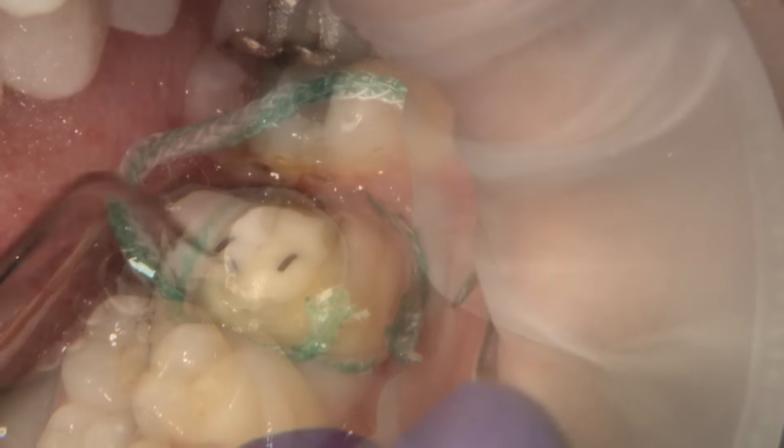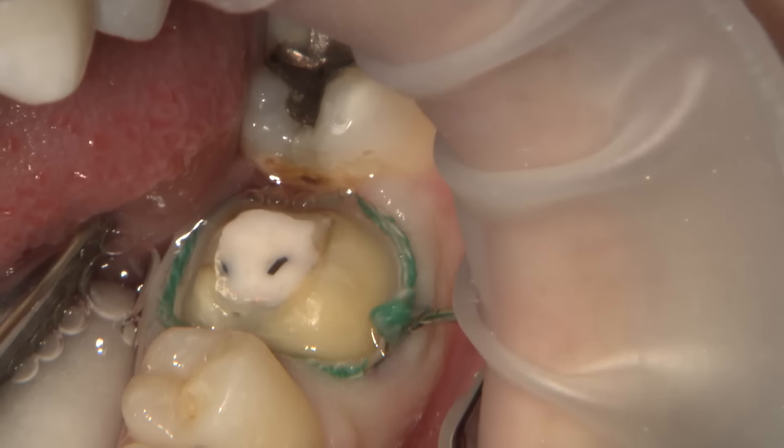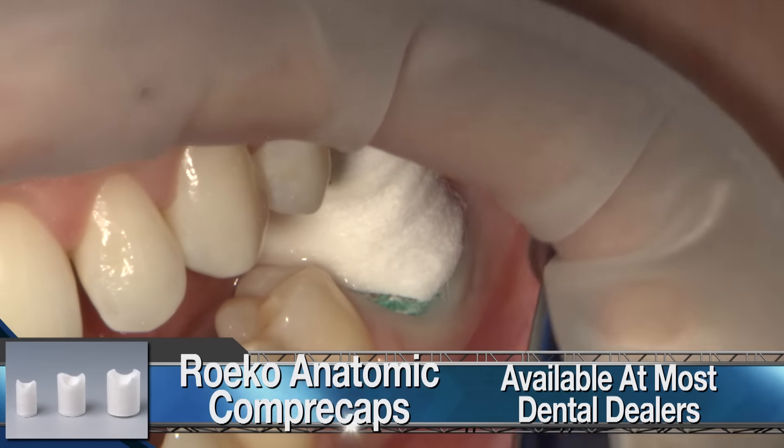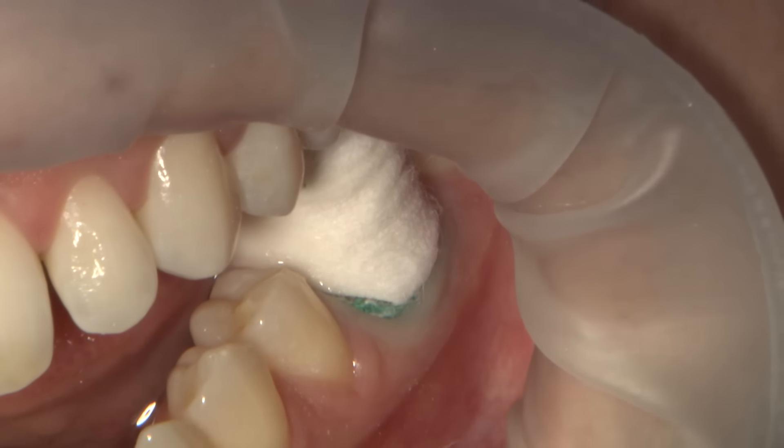A size two cord is placed after the margins have been finished to help move the soft tissue laterally away from the prep. This larger second cord is really important to ensure that we create a space between the hard and soft tissue to allow for proper margin identification. The patient bites on a Comprecap for at least five minutes to ensure the cord stays in place and also aids in hemostasis.